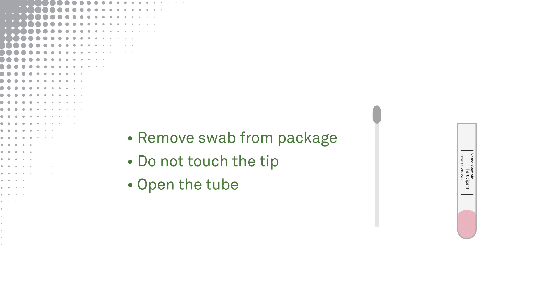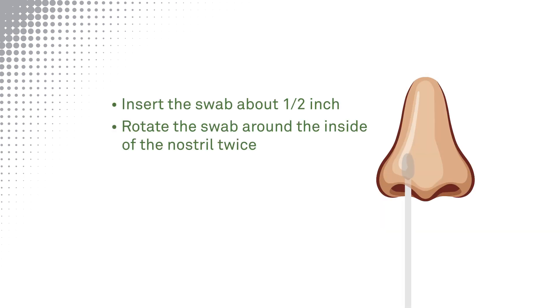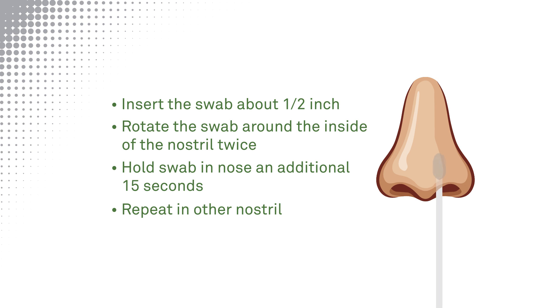Do not spill or drink the liquid. Insert the swab into one nostril about half an inch. Rotate the swab in a circular motion around the entire inside edge of the nostril. Do this two times and then keep it in place for 15 seconds. Repeat the same process in the other nostril using the same swab.